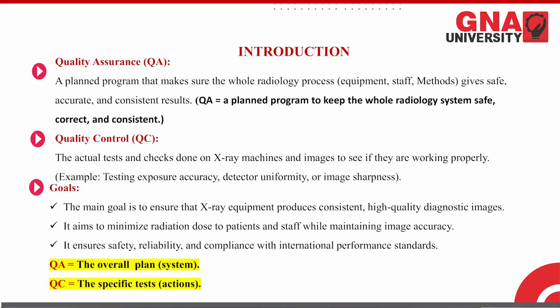And next, what is quality control? Quality control is the actual tests and checks done on the X-ray machine and images to see if they are working properly. These are the tests to see whether my X-ray equipment is working properly and producing a high quality image or not. Going through these tests, we call it quality control.